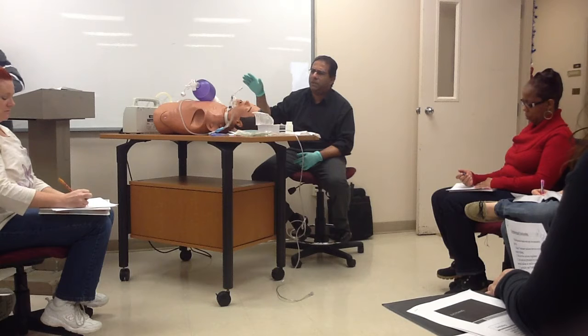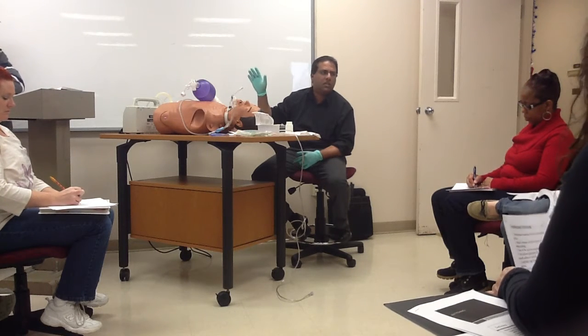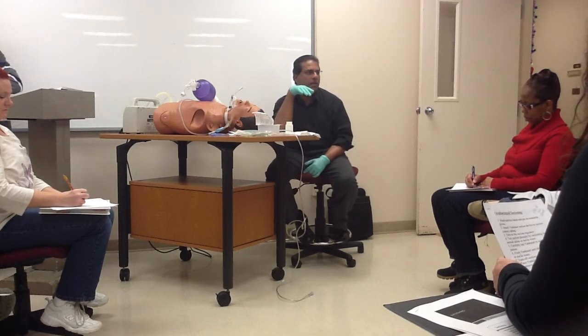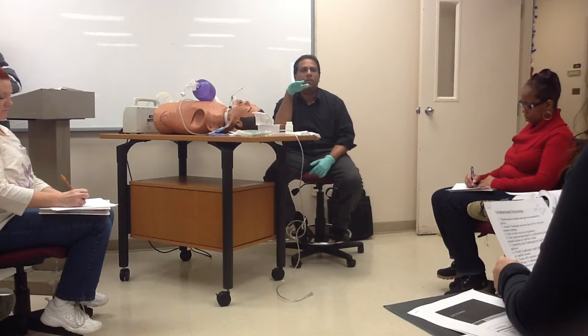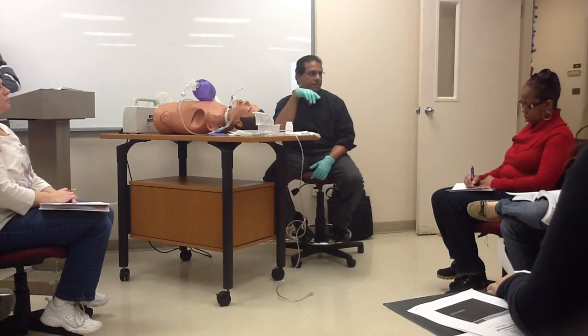I've never seen a suction catheter of 16. I think the 14 is the largest that I saw. So you can actually go down to 12 or 14 before the number 8. That's pediatrics, a whole different world.